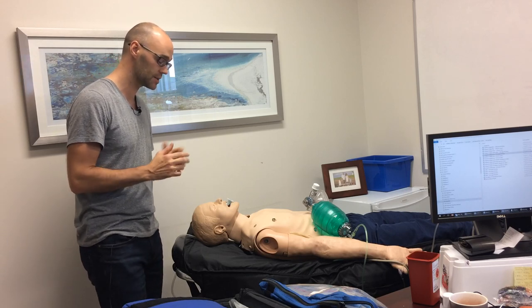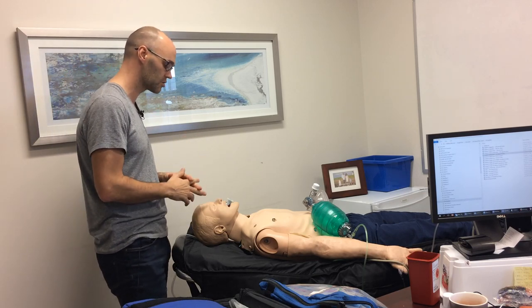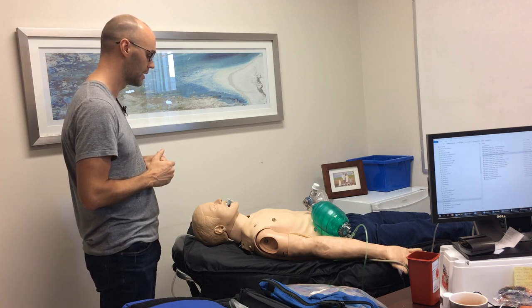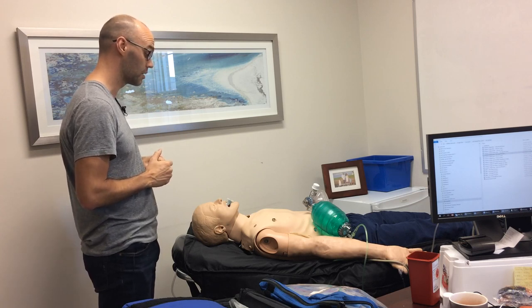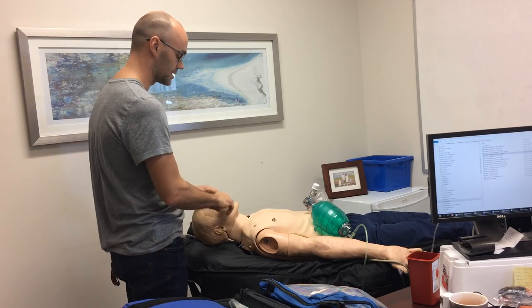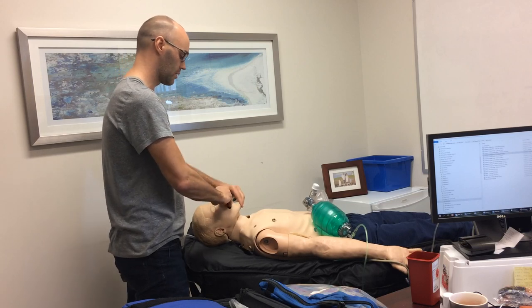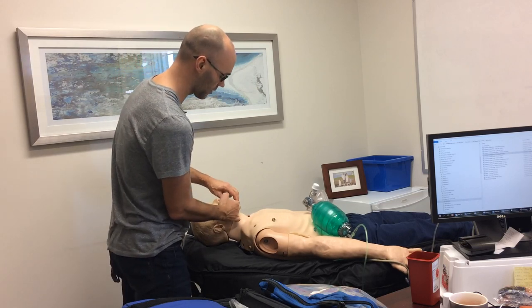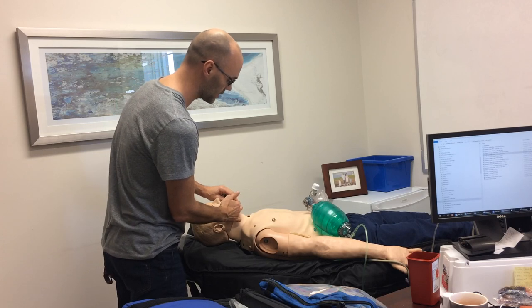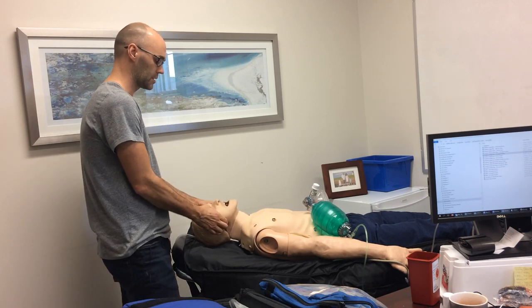You're going to look externally: any obvious trauma, abnormalities of the face, narrow jaw. Then we're going to evaluate 3-3-2 — assessing based on the size of the patient's fingers whether or not we think we can fit three fingers in their mouth. He's got two fingers, he's got three here, he's a bit one and a half, and he can sublux his jaw.